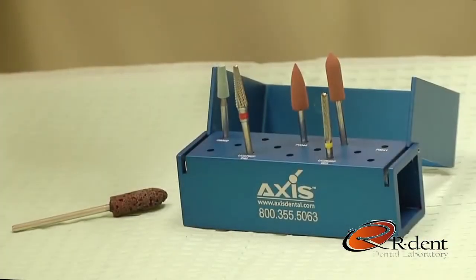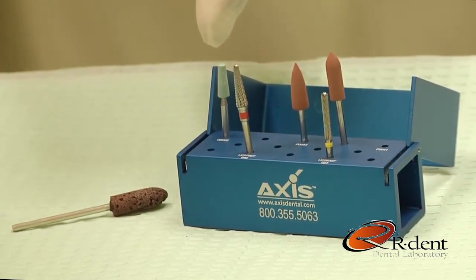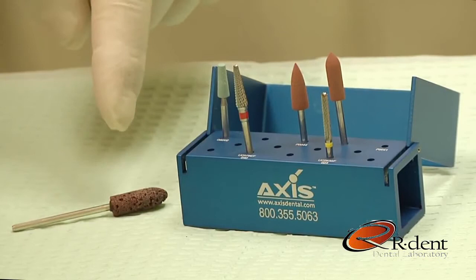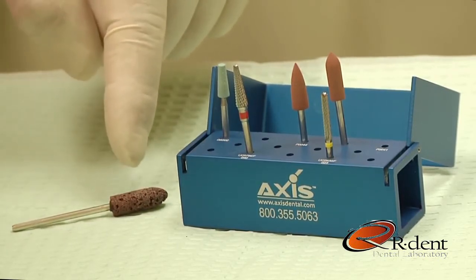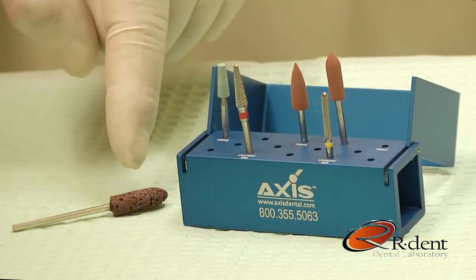To make these adjustments, we will be using a Valplast adjustment kit from Axis Dental Products. This kit consists of a fine and a superfine NTI universal cutters, two NTI brown silicone polishers, and a ceramic Supermax mounted greenstone. We will also be using a Valplast bullet-shaped trimmer, which is not included in the kit, but will be provided complimentary with your first case from Ardent.